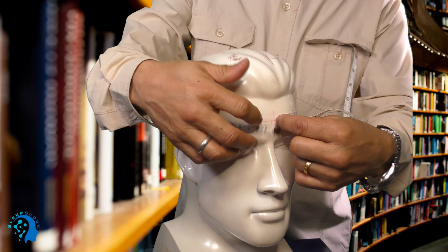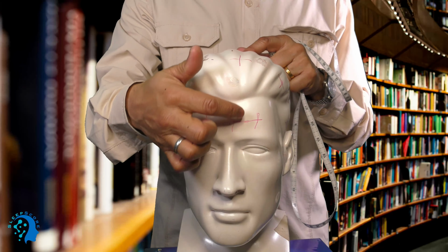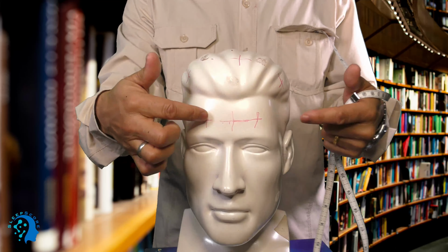Now because we don't use this forehead, like prefrontal, to do the hookup, though some people use it too, you can use it as a reference on either side or any of these three points. It is easier sometimes. We measure these points so that I can find my FP1.